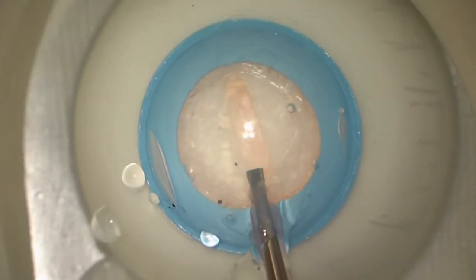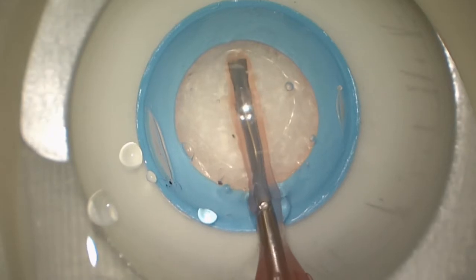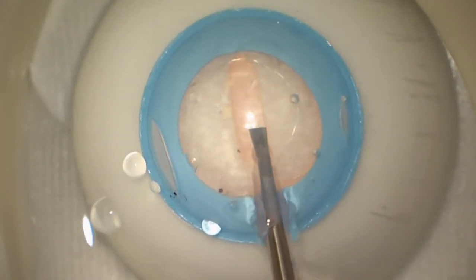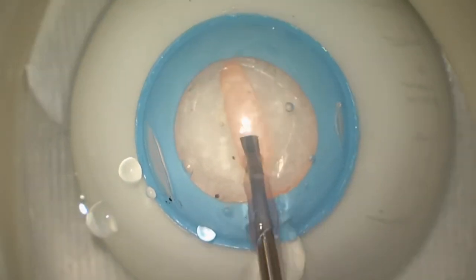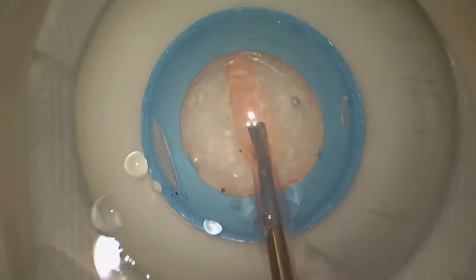You can see how these PS12 eyes are a pretty good simulation for the groove. We're able to talk about the techniques of the groove, discuss the machine settings, and it really allows a nice simulation of the groove.